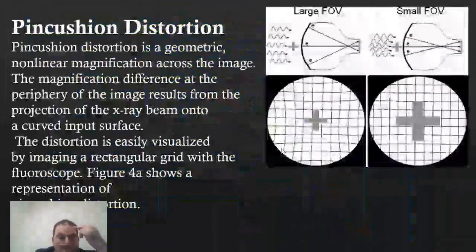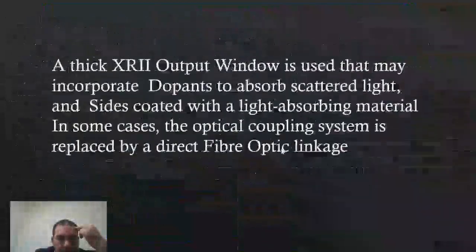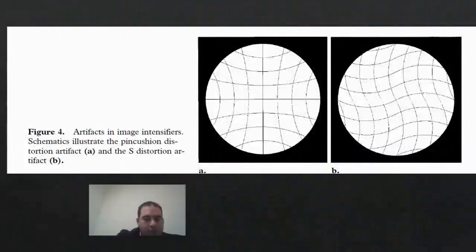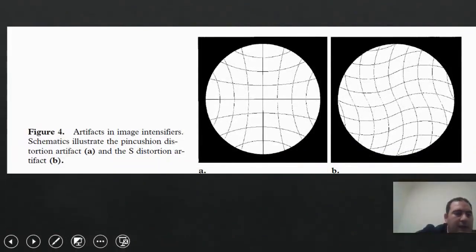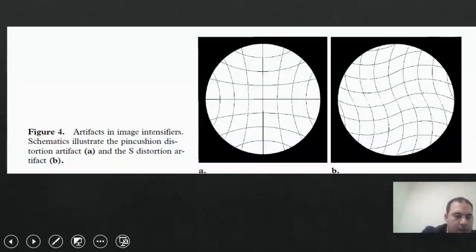Currently, if there happens to be a strong magnetic field affecting the area near the image intensifier, there are electrons present, and these electrons, which are in motion, are being carefully focused. It itself generates a magnetic field.